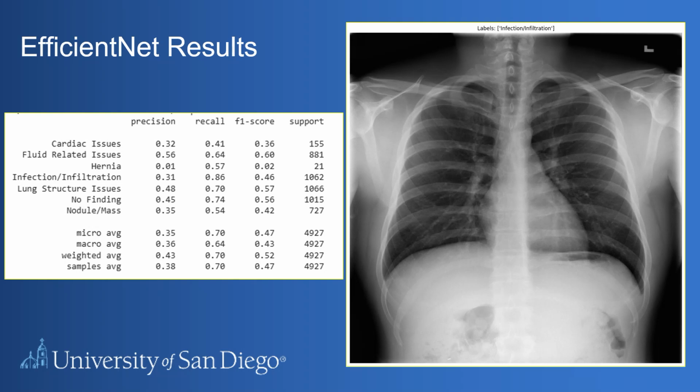So as with all medical pathology, the thinking here is we optimized our recall to be as high as possible for EfficientNet, such that it would not miss anything, and a medical professional would review or order more follow-up tests to figure out what is or is not important to diagnose.